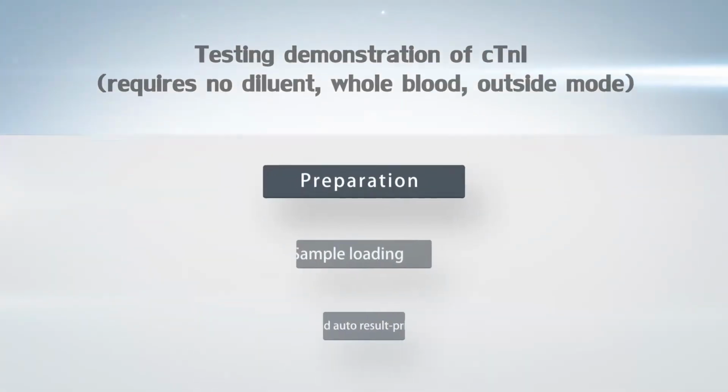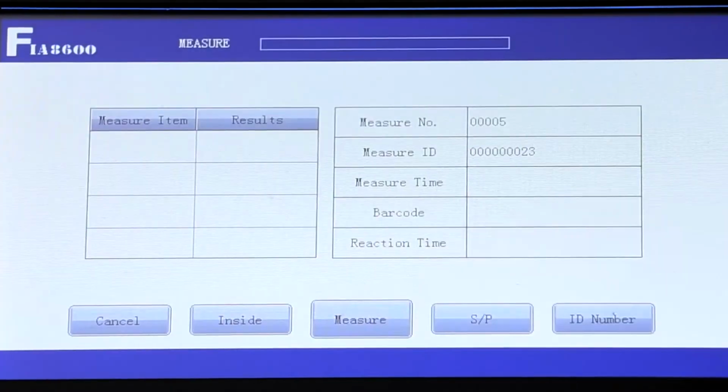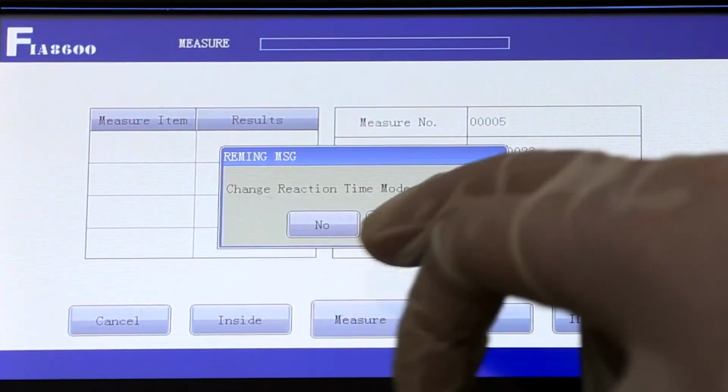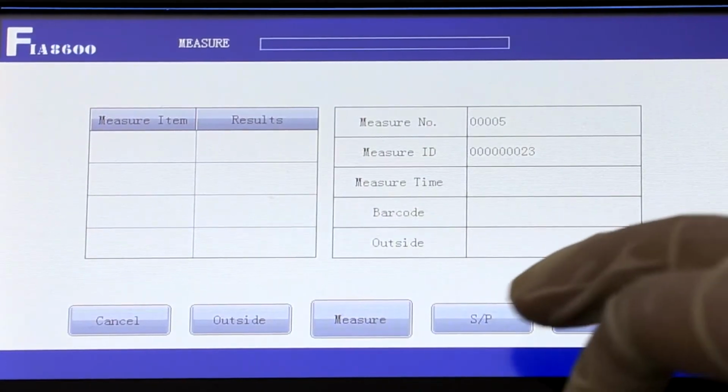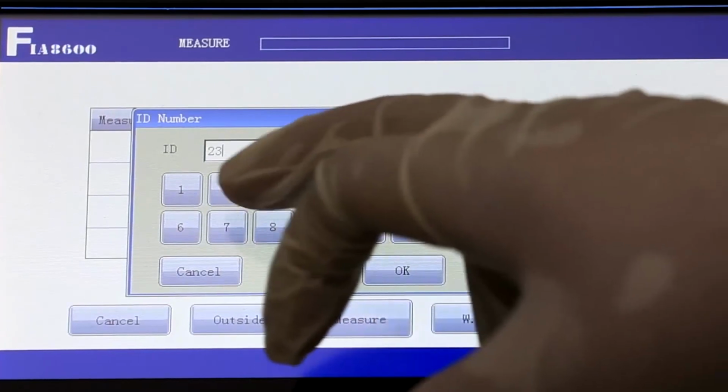Testing demonstration of CTNI. Step 1. Preparation. SD card quality control. Parameters. Outside mode. Whole blood. ID value.